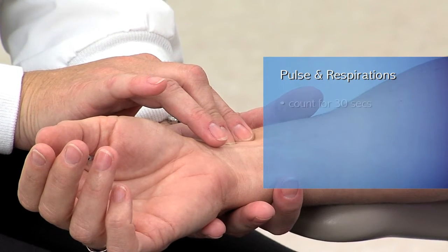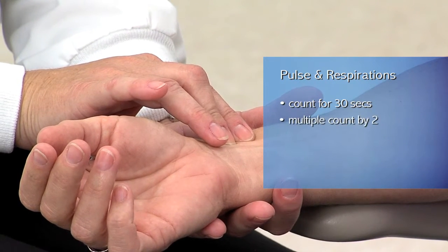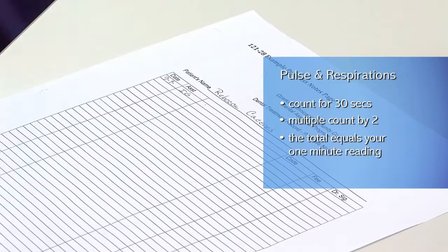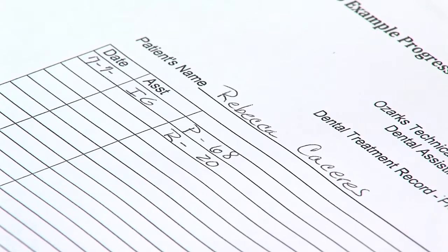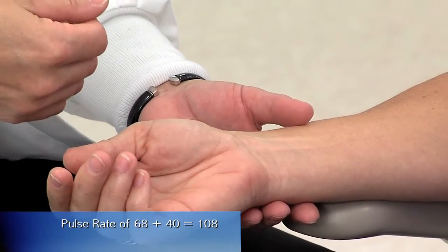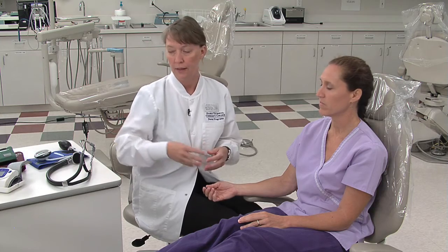Once you've completed taking the pulse and respirations, you will multiply both of those numbers by 2 to get a 1-minute reading. This is what you will record in the patient's chart. Once you've recorded the pulse and the respirations in the chart, you will then calculate the number for the sphygmomanometer. What you want to do is take your 1-minute pulse reading and add 40 to 60 millimeters of mercury to that number. The pulse rate that we have for Rebecca is 68. So we're going to add 40 to that, giving us 108. And that will be the number that we will pump or cuff up to when we take the blood pressure.